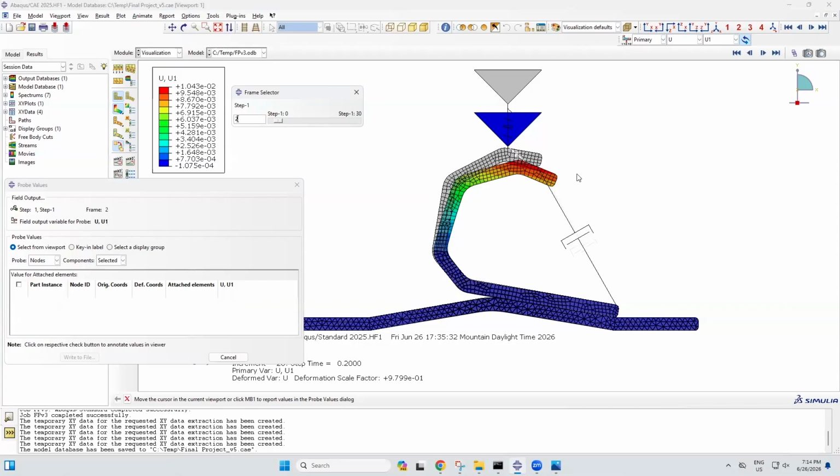Now, step 2 has a horizontal displacement of approximately 9 millimeters to the right. The vertical displacement is 1.25 centimeters downwards. Step 3 has a vertical displacement of 1.2 centimeters downwards, which is smaller than the deformation in step 2. This is because the part has passed equilibrium and is now returning to equilibrium.